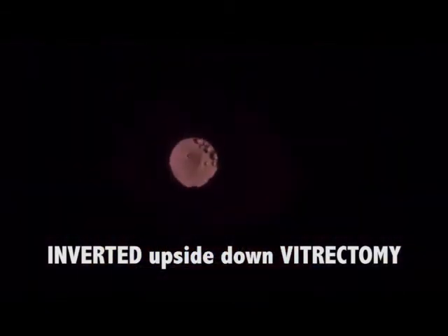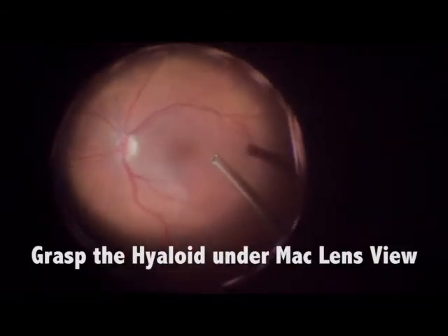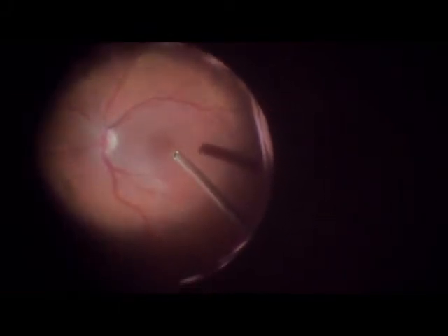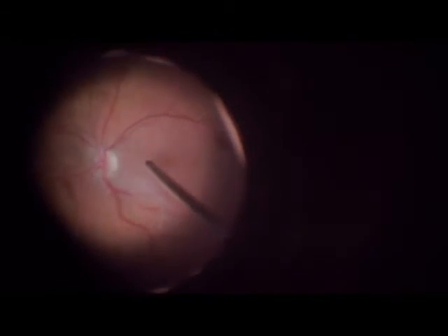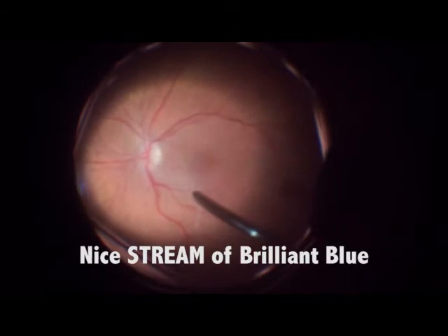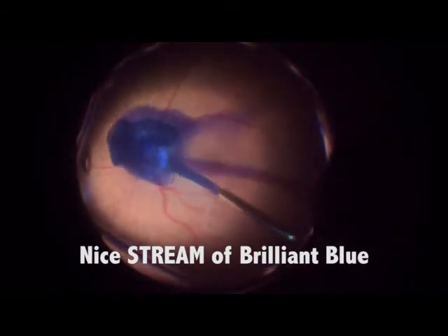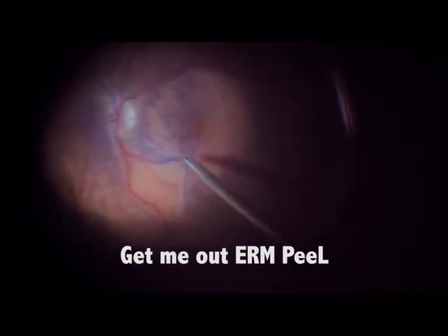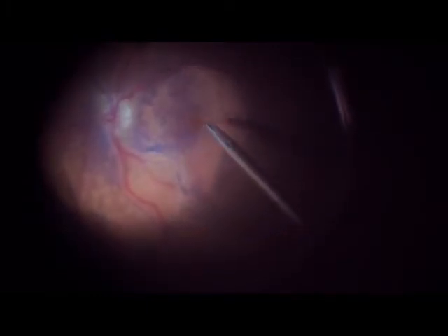We start the case with a core vitrectomy, then we go after the hyaloid, grasp it, and try to relieve all tractions. After that, we insert a nice stream of brilliant blue, as you see, and you better visualize the epiretinal membrane.